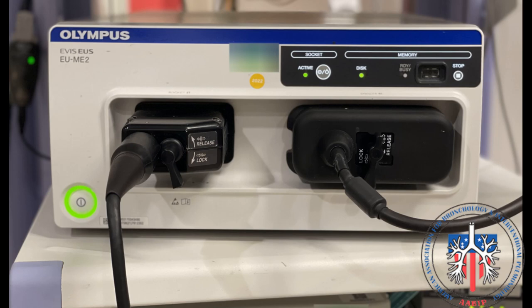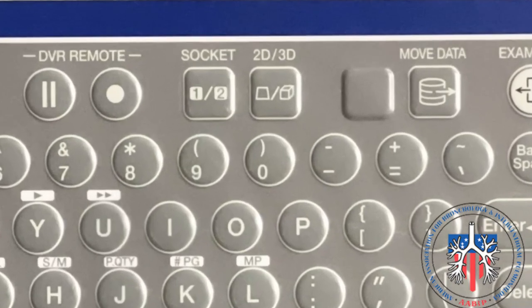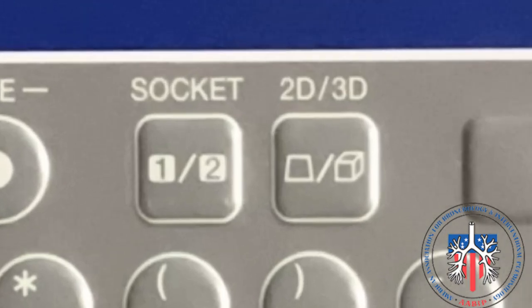Both the convex and radial ultrasound systems use the EU-ME2 processor. On the left is the attachment for the convex probe and on the right is the attachment for the radial probe. The radial probe attachment extends to the probe driver unit. To toggle between the convex eBUS and radial eBUS, press the socket button.